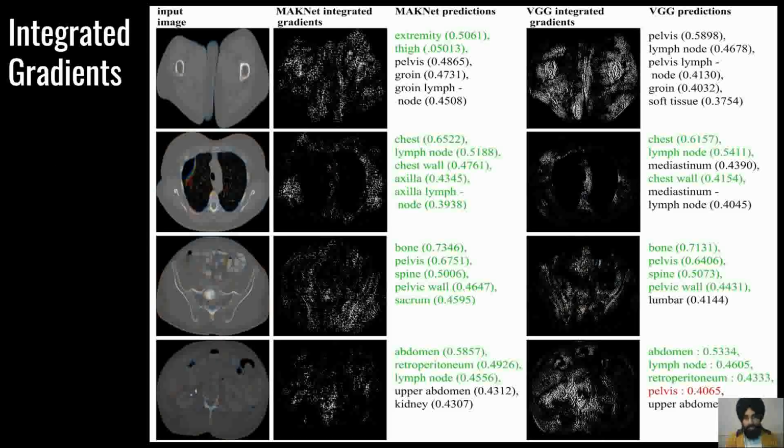Integrated gradients is a recently introduced alternative that avoids saturation. Saturation is caused by essential features having tiny gradients. Integrated gradients creates a sequence of linearly interpolated images from a baseline, which is a black image, to the input image, and integrates the gradients of the output with respect to this series of interpolated images. This method provides both sensitivity to changes as well as invariance to implementation.